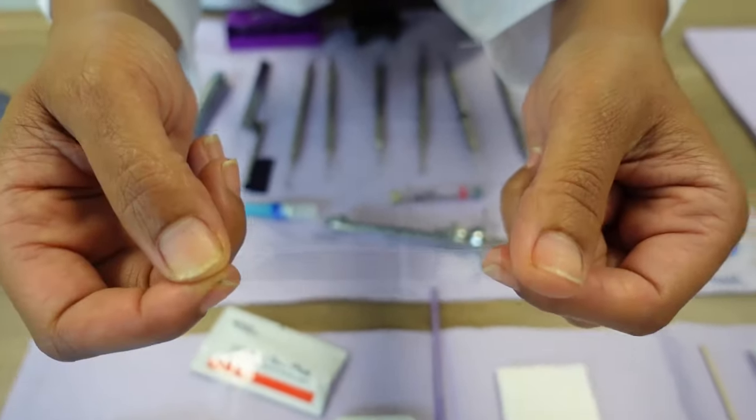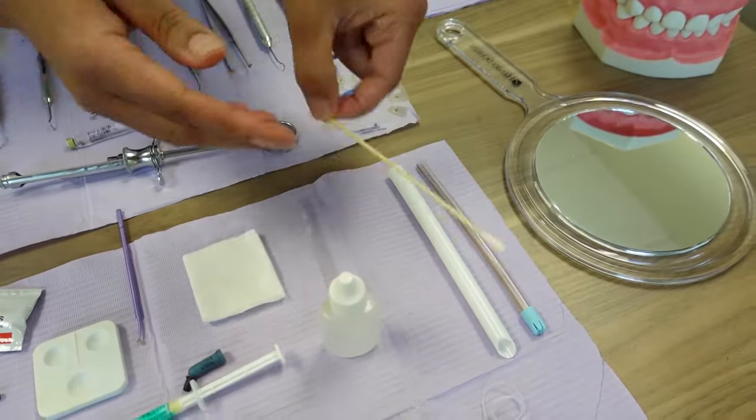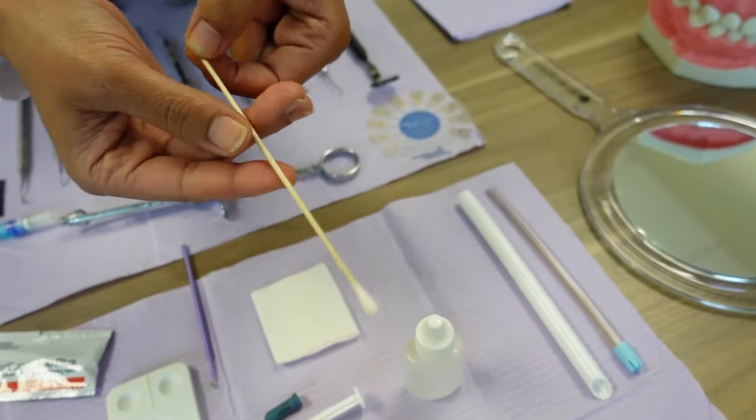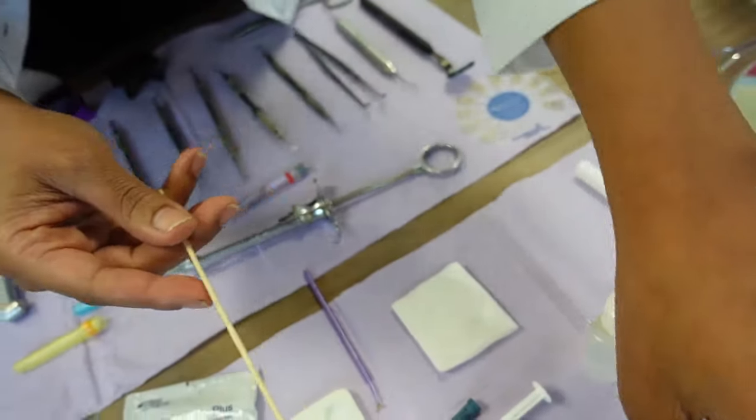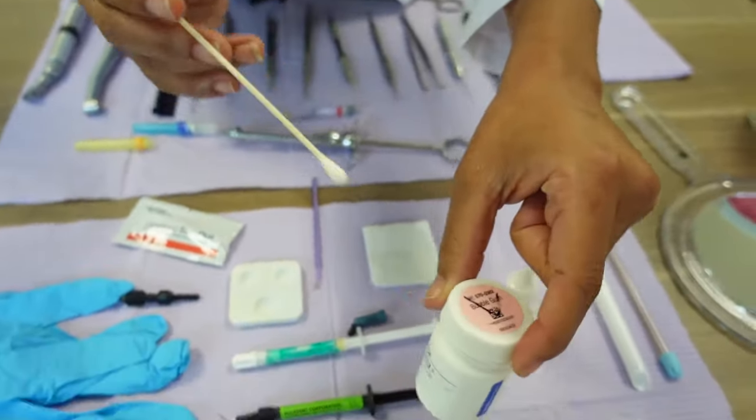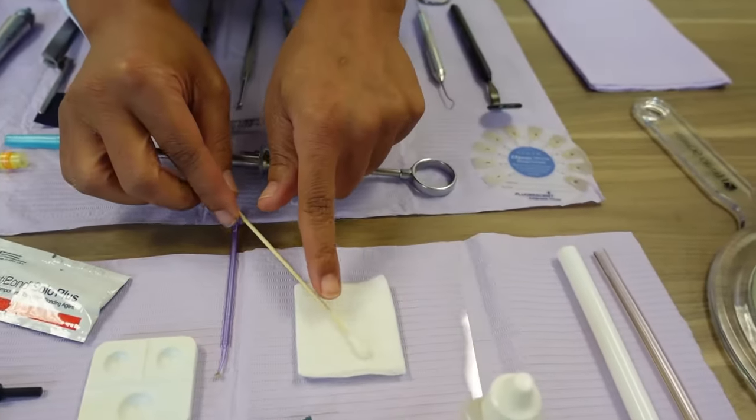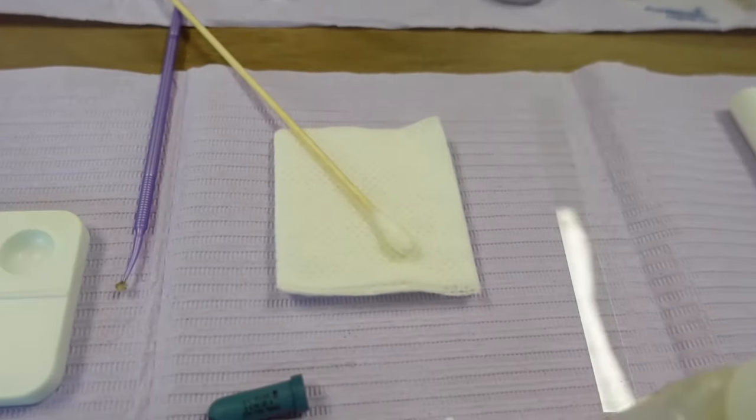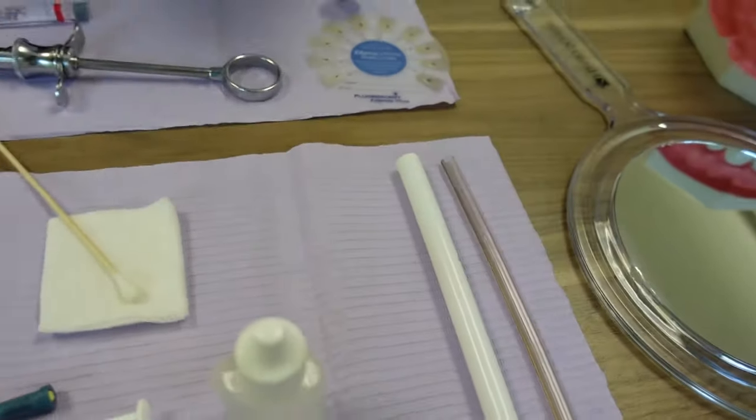This here is a cotton tip applicator. We use that when we're getting ready to set the patient up for anesthesia because we have our topical. We dip it in the topical, sit it on top of a two-by-two gauze, have it set and ready. When the patient comes in, you swab the area that's going to be worked on, and you're good to go.